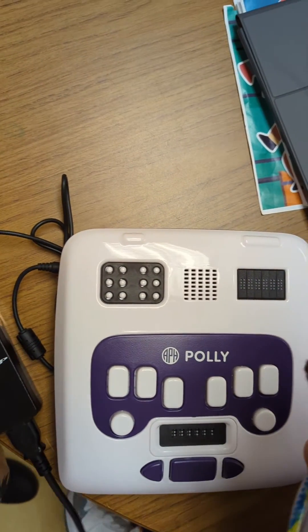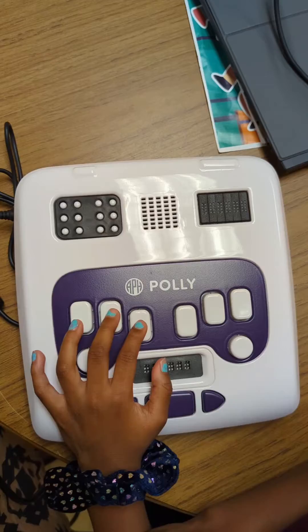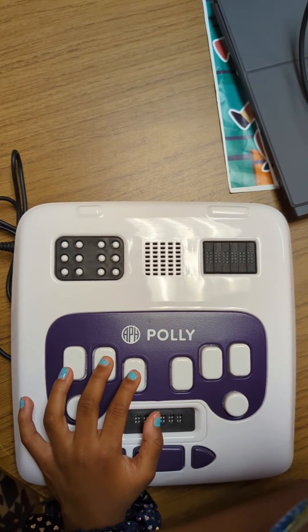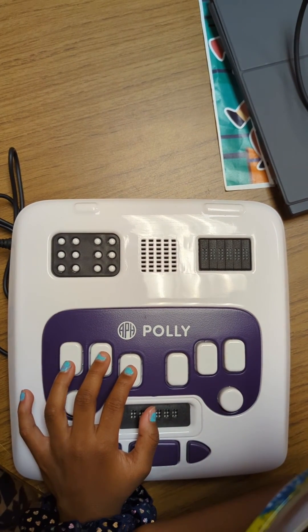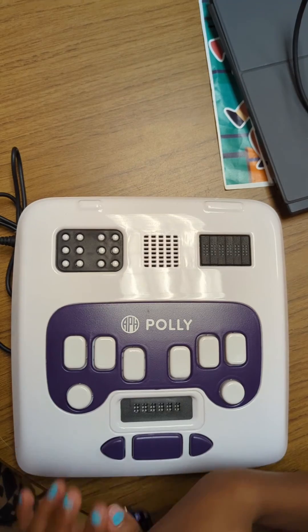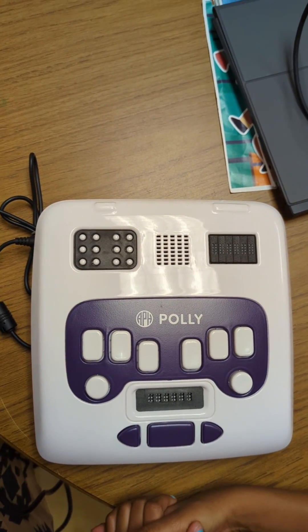Wonderful, you got that right. Good job. Now press keys one and three. Great job, that's the right answer.